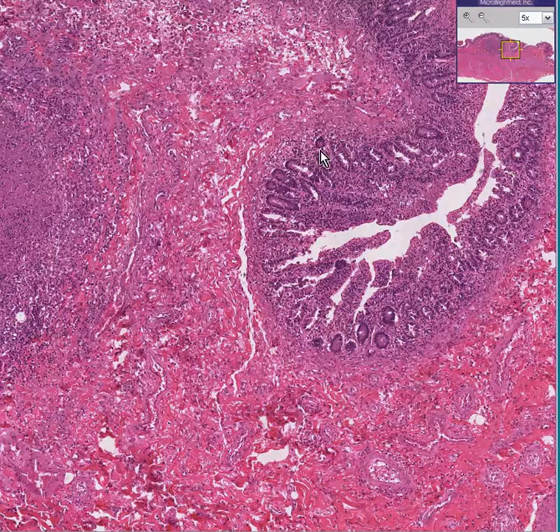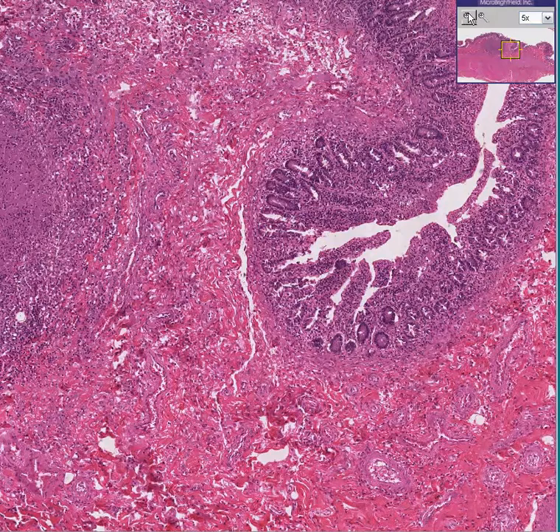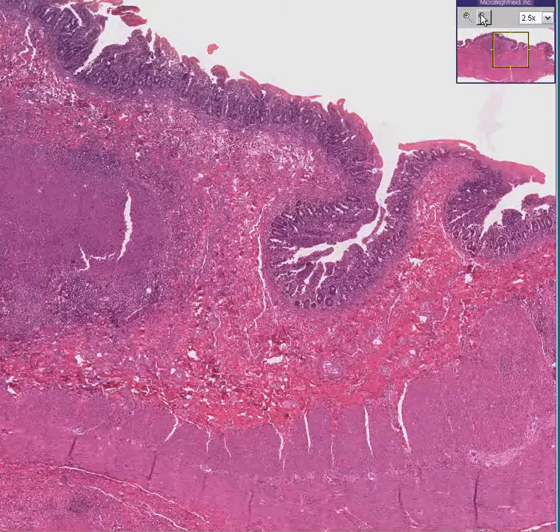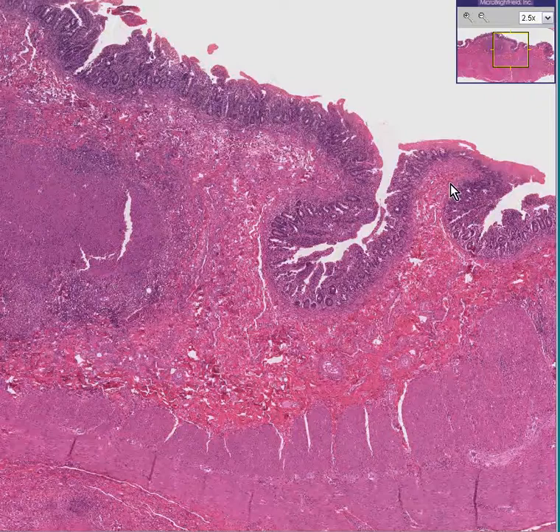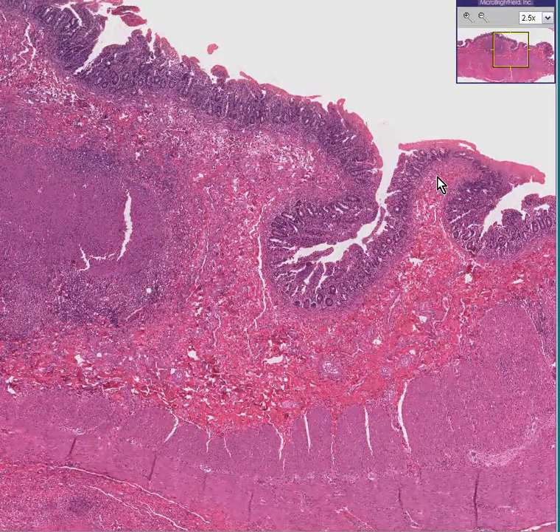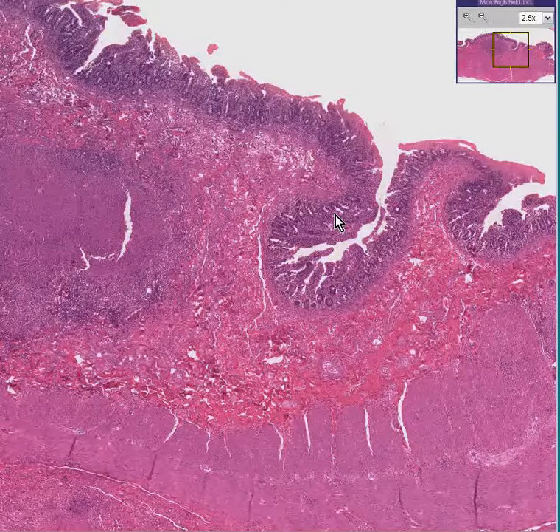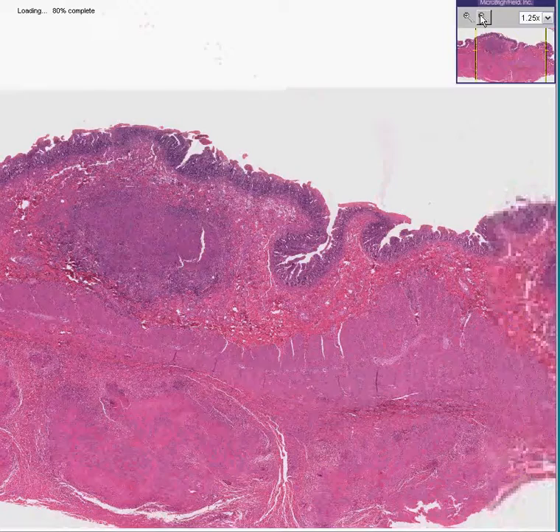So you know it's a stomach. These little submucosal infoldings would be rugae, rather than plicae if it was the small bowel, or haustra if it was the colon.